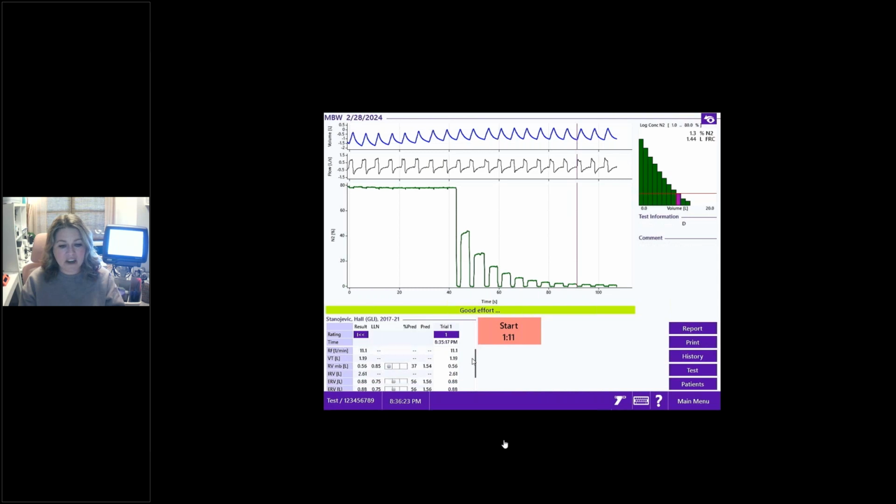All right, you'll see here I am scrolling down so that you can see all of the different parameters that I have plugged in. If you see that my reserve volumes are low, you are correct. I am an asthmatic who is still holding on to a little bit of long COVID, especially in my volume parameters. So nobody be concerned. I know my FRC is 45%, but we're still working on it. We're getting ready to do that second maneuver.